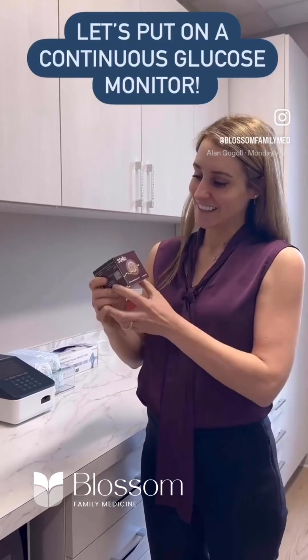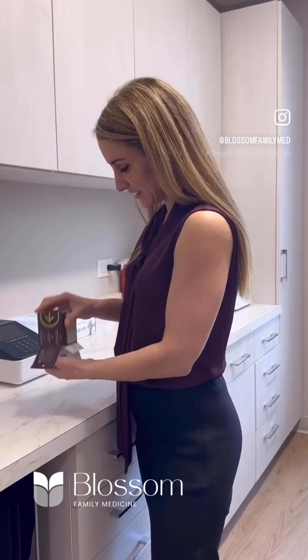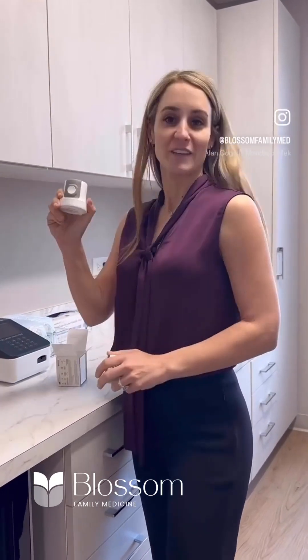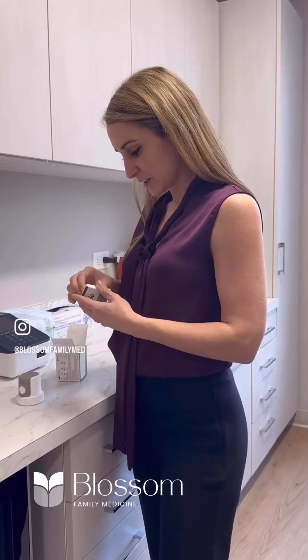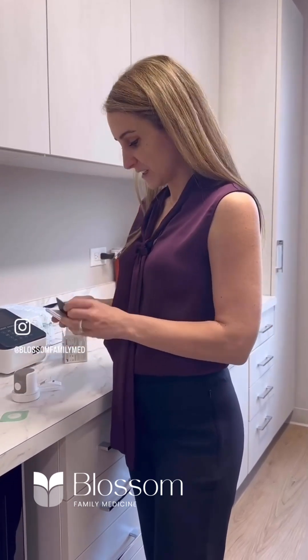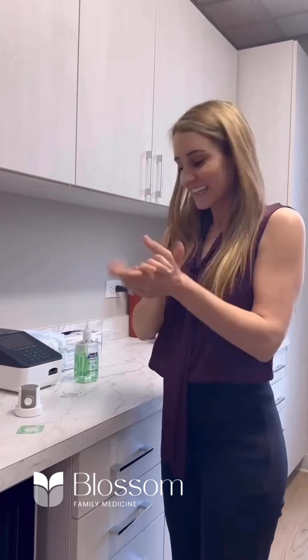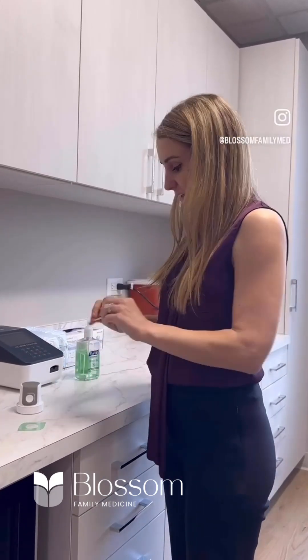Today I'm using a Stelo continuous glucose monitor and I'm going to put it on and show you guys how to do it. The Stelo glucose monitor is great for non-diabetics — it shows you what your sugars are and gives you more information. In the packet is the continuous glucose monitor, instructions, and a sticker.